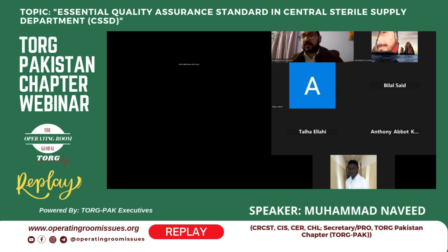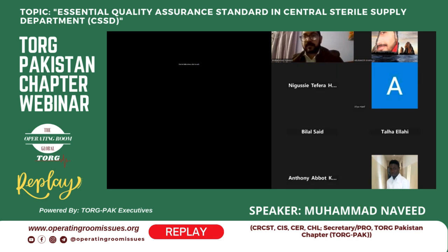There are two basic types of shelf life. One is event-related shelf life, and the second is time-related. Some hospitals and CSSDs have an event-related policy, meaning that when some event happens, we recall all the items, and they come back to decontamination, then disinfection, packing and sterilization again. Some hospitals give a time-related expiry, meaning shelf life.